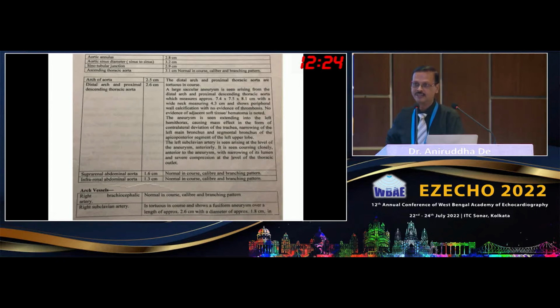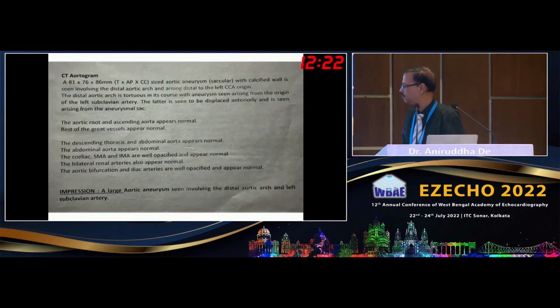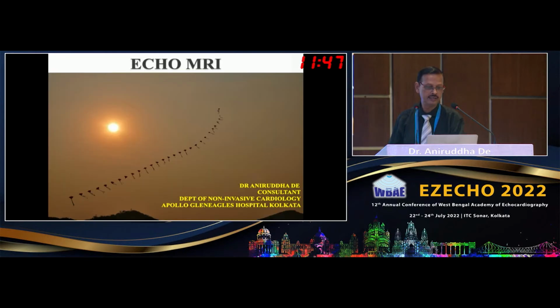Okay, sir. So it could be a pseudoaneurysm or an aneurysm. I'm still impressed by this, but to be on the safer side, call it an aneurysm. Pseudo or true doesn't make a difference. You still have to chop it off and repair it surgically. Is there any difference in doing it? Obviously, a pseudoaneurysm is much easier to control, and if there is a pseudoaneurysm, then there is nothing to do in the neck. Anyway, now we'll go to the next case.